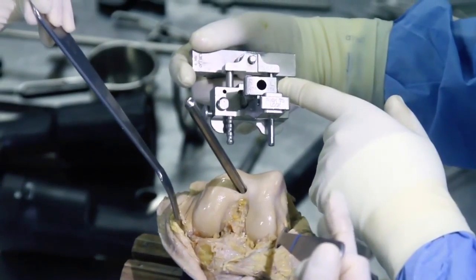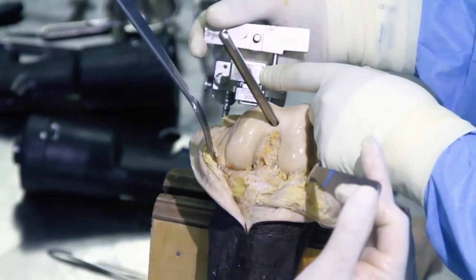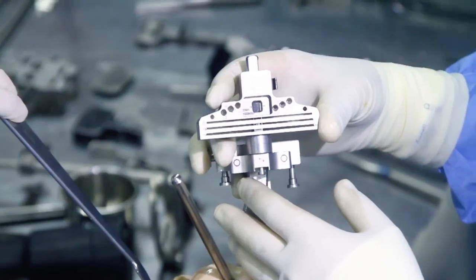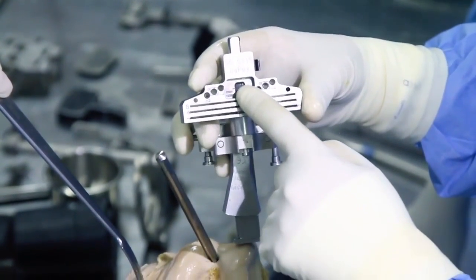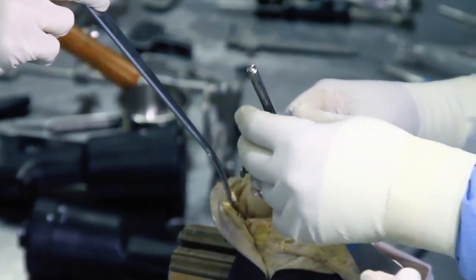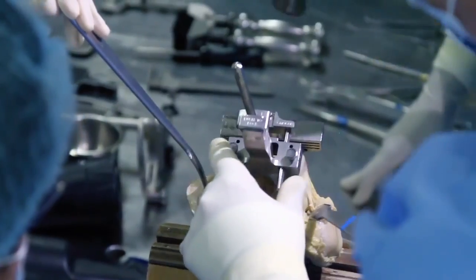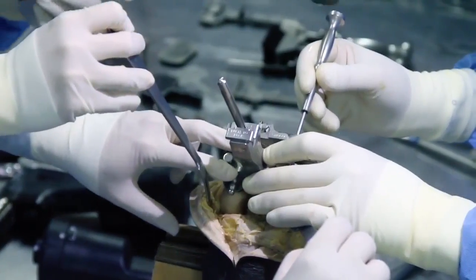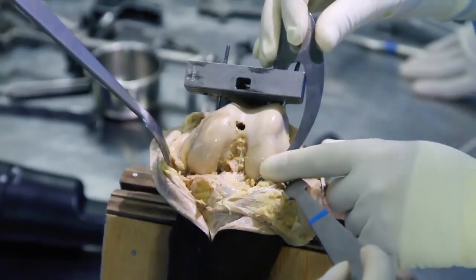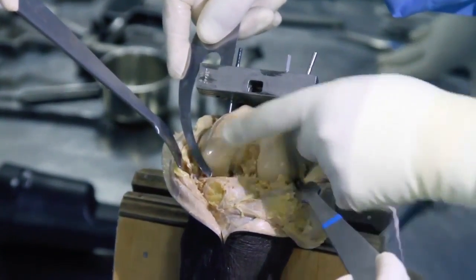So we're on the left side, having 5 degrees. This shows us how much resection we're going to do. On the other side, it should be 9 millimeters.